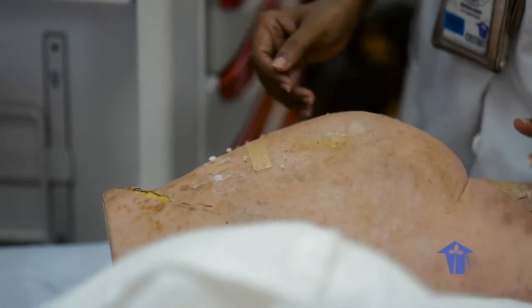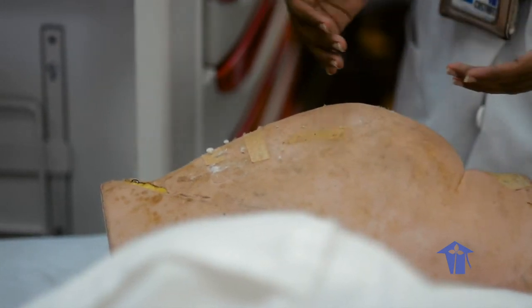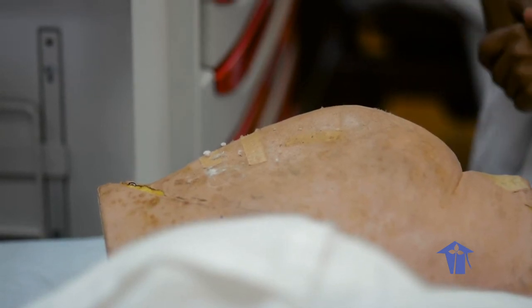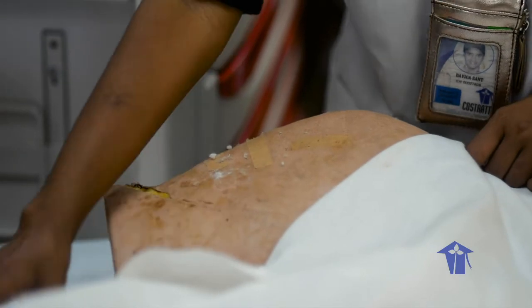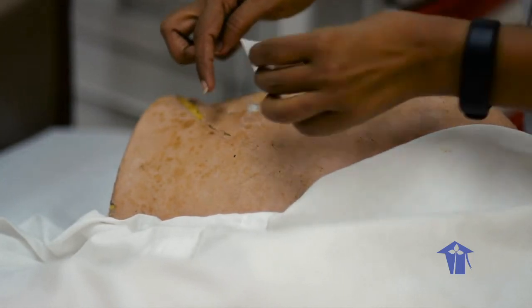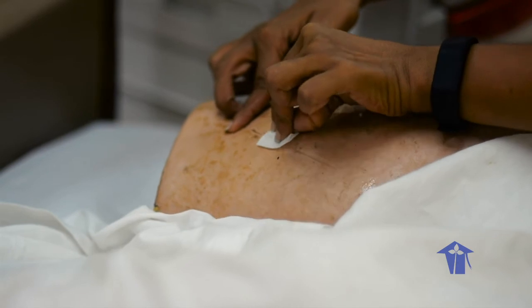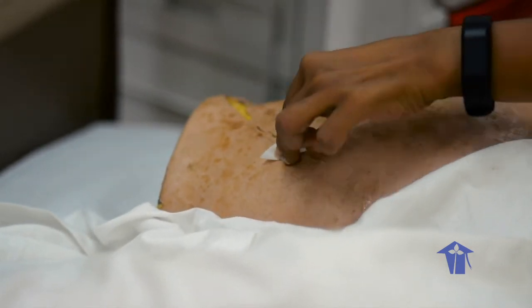Assist the patient to the appropriate position for the site chosen. So I've already spoken to the patient and we have selected the appropriate site that they are comfortable with. Drape as needed to expose only the area of site being used. Cleanse the area around the injection site with sterile swab. And I'm wiping in a circular motion.